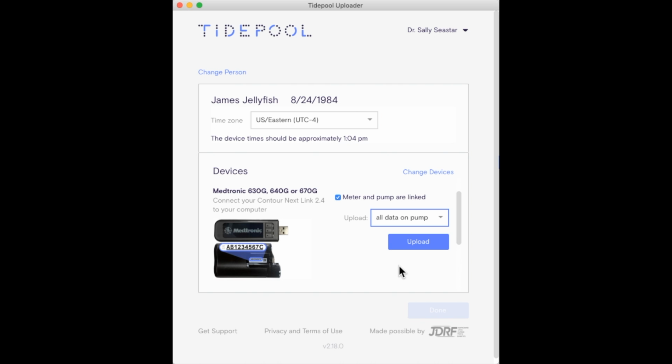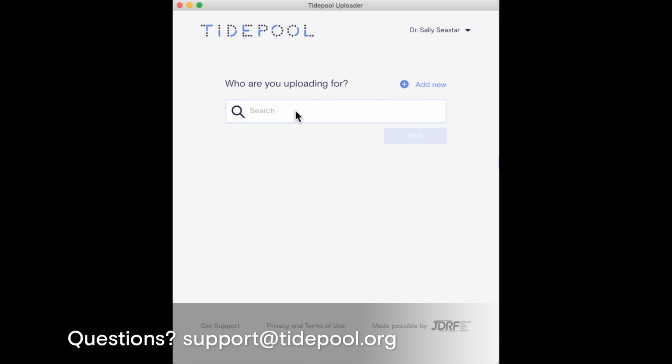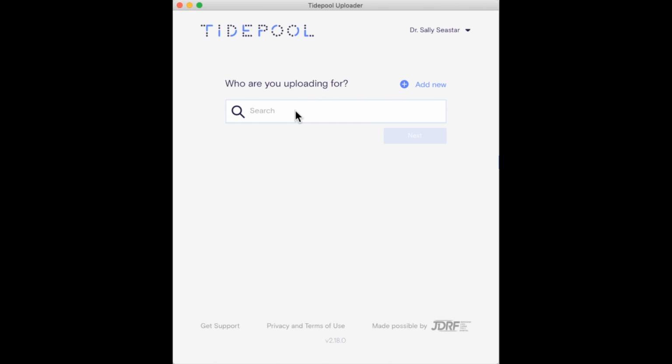Once you've completed uploading data for a given patient, simply click Change Person at the top and you're brought back to this friendly search bar and you're ready to upload data for a new patient. If at any point you have any questions about installing or using Tidepool Uploader, please do not hesitate to send an email to support@tidepool.org. Now that we've covered Tidepool Uploader, let's take a look at what your patient's data looks like in Tidepool Web.